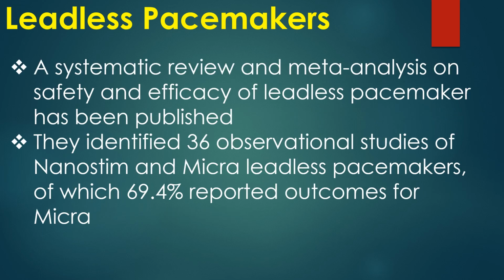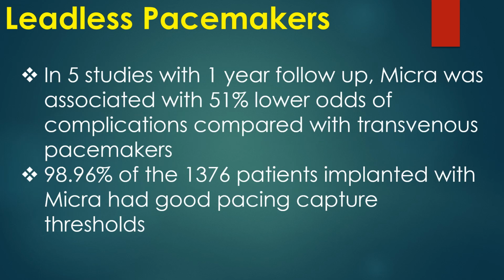A systematic review and meta-analysis on safety and efficacy of leadless pacemaker has been published. They identified 36 observational studies of Nanostim and Micra leadless pacemakers, of which 69.4% reported outcomes for Micra. In 5 studies with 1-year follow-up, Micra was associated with 51% lower odds of complications compared with transvenous pacemakers.